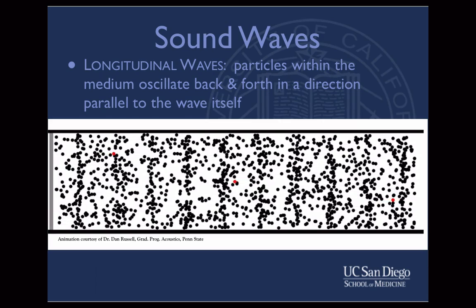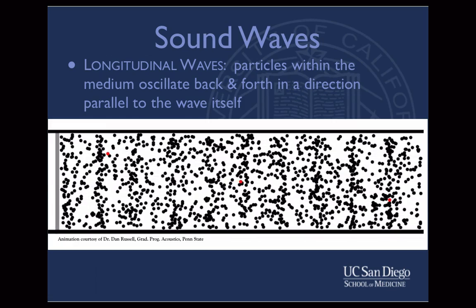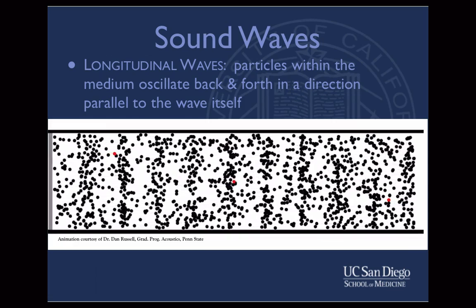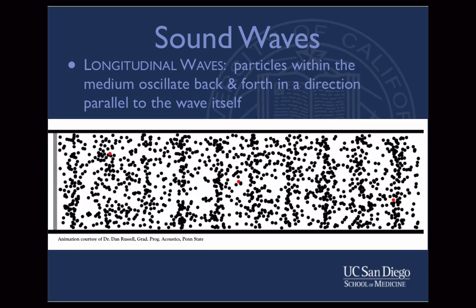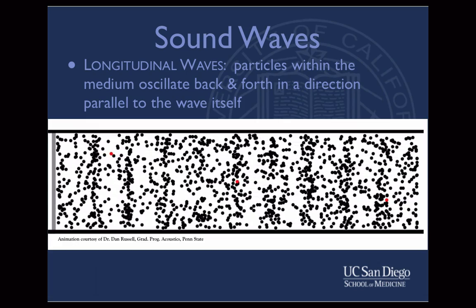This reinforces the idea that waves do not transport particles in the medium, despite transporting energy from one side to the other. This also reinforces the concept of alternating zones of compression, where the particles are in maximum density, and rarefaction, where particles are more spread apart.